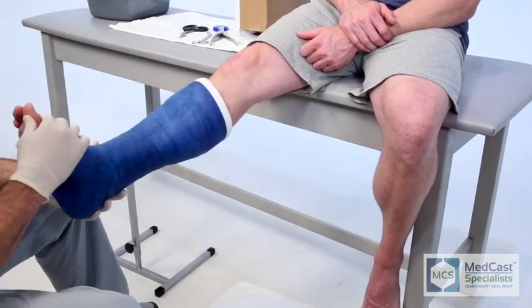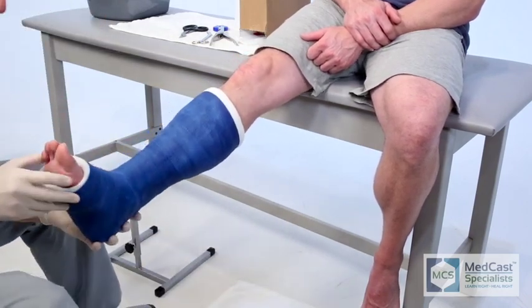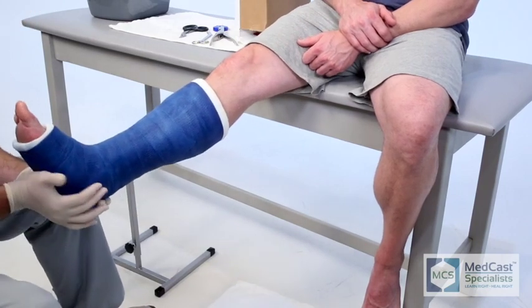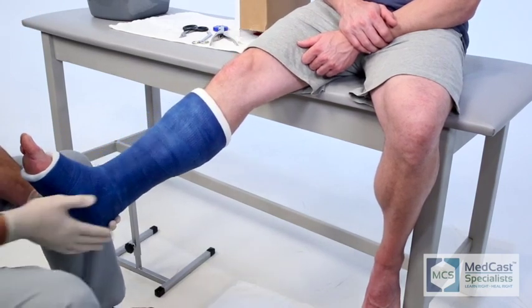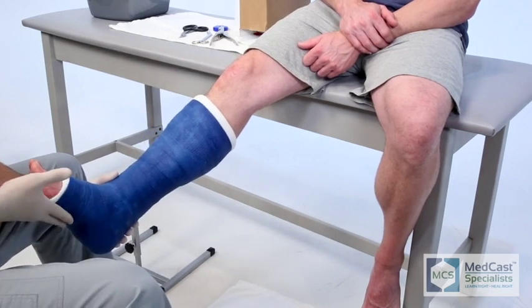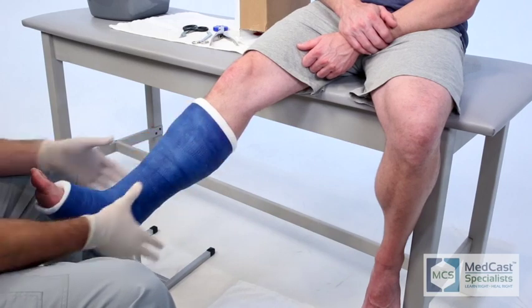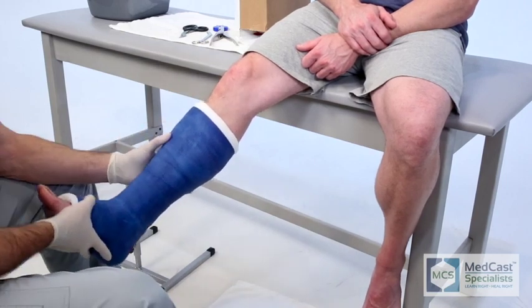We're doing an evaluation — it's always a good thing to do. I really like to look at the cast when it comes back after a two to four week healing process and see how much breakdown or any imperfections may be in there. We've said it before and we'll continue to say it: you learn from your mistakes.